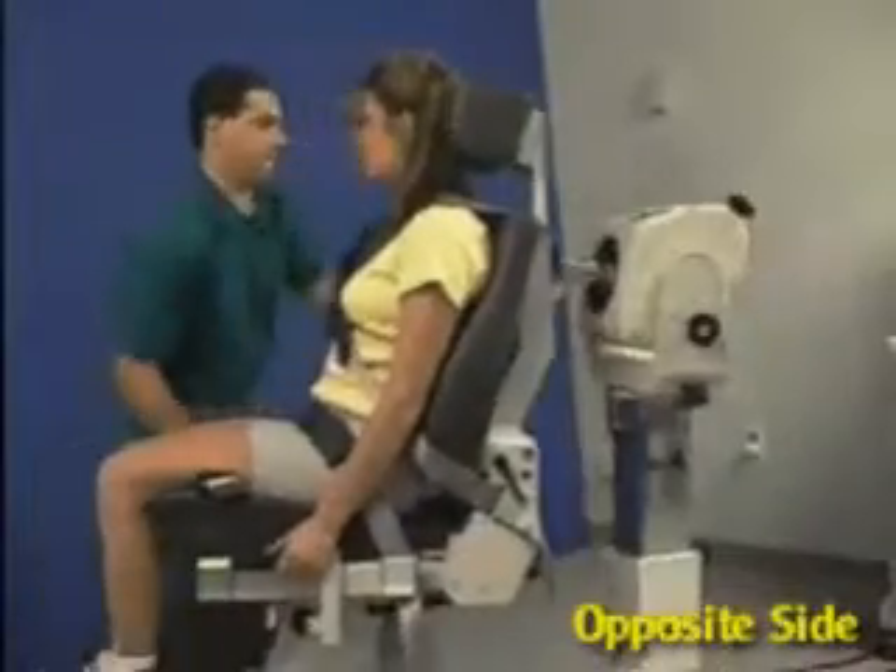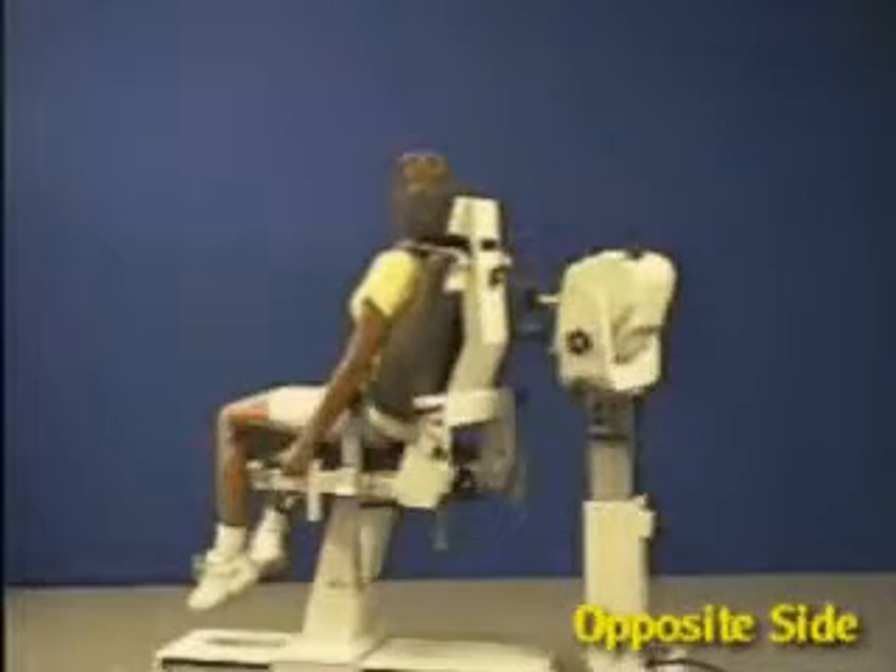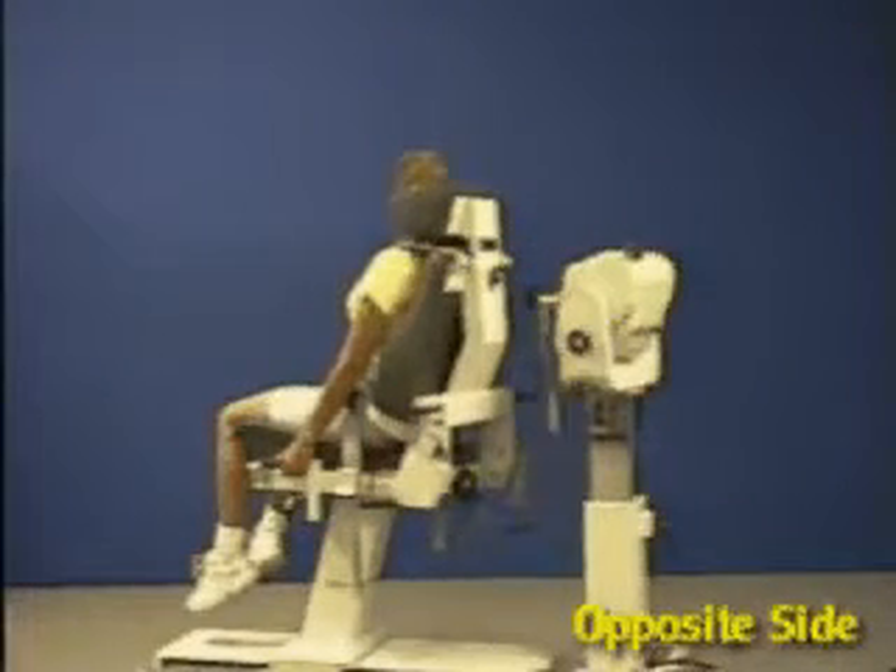Move patient into position and reset range of motion stops.